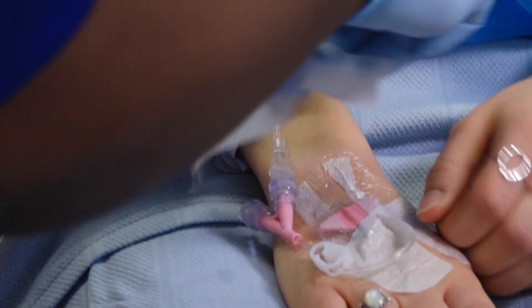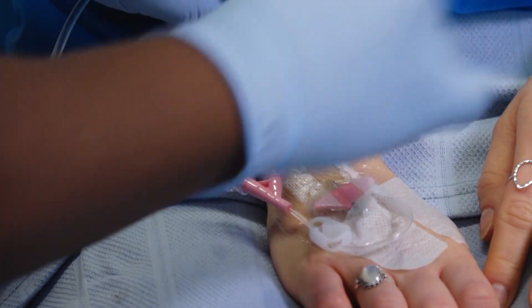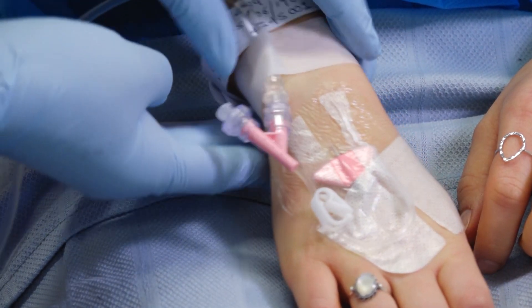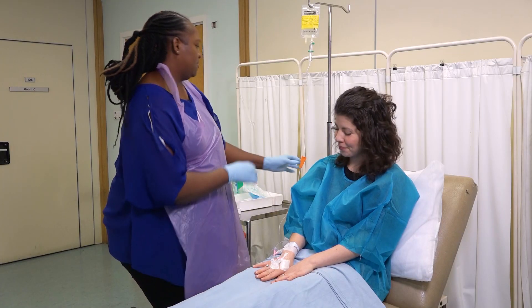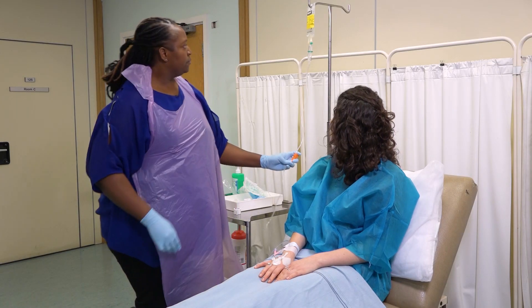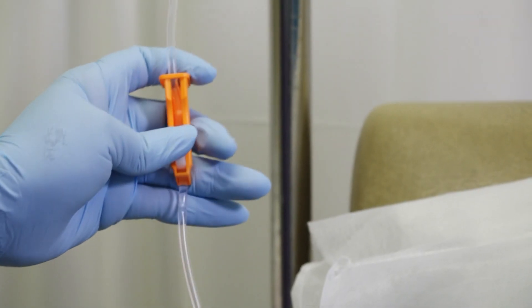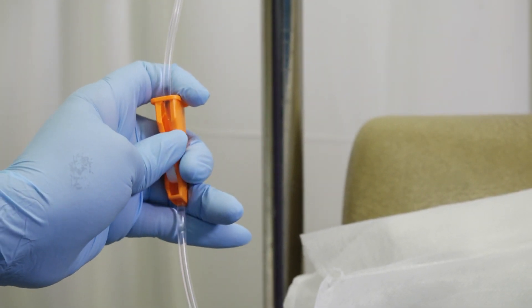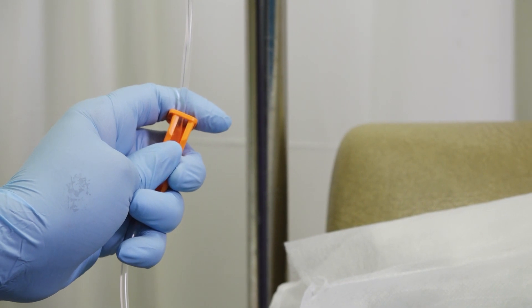Secure the cannula and tube with tape if necessary. Set the drip rate according to the prescription.